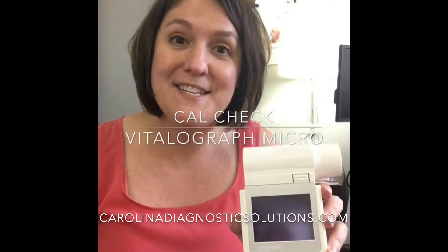Hi, this is Amanda from Carolina Diagnostic Solutions. I want to talk to you all today about how to do a quality check on your microspirometer.